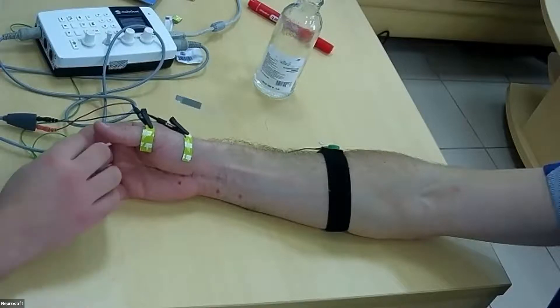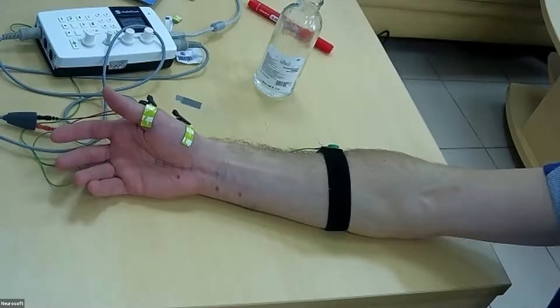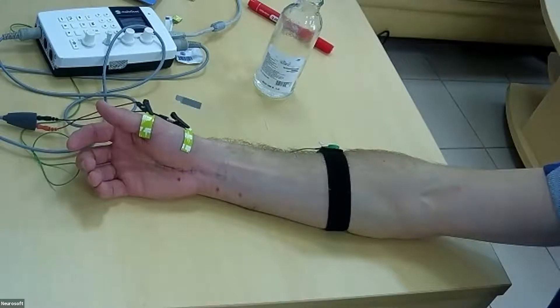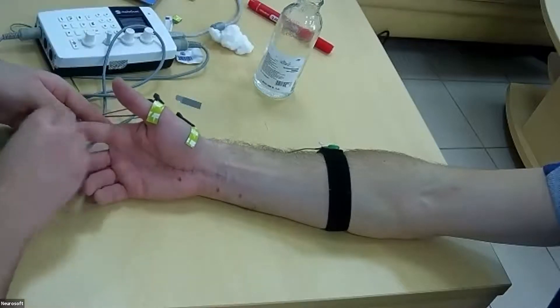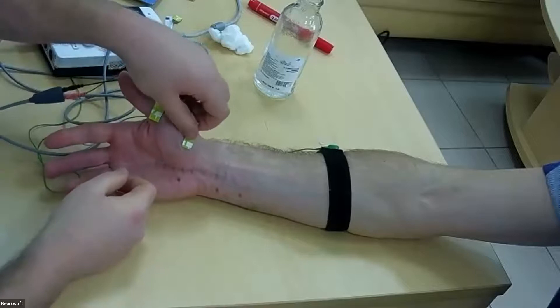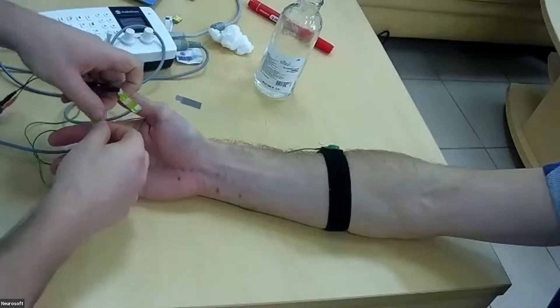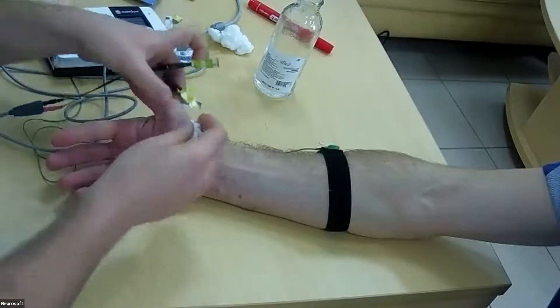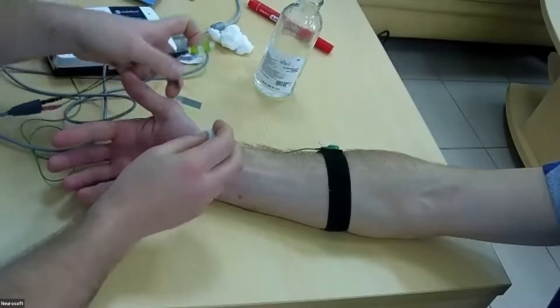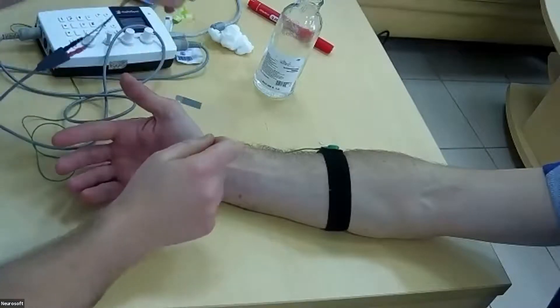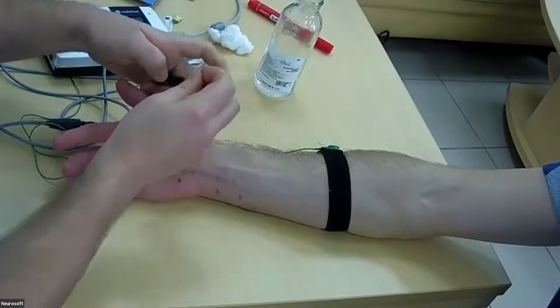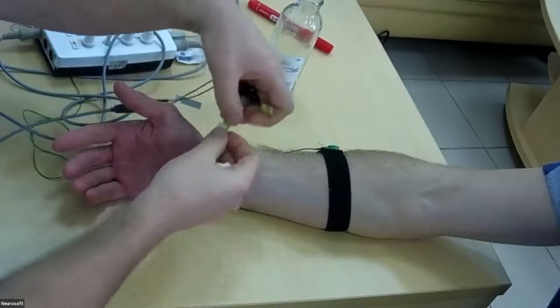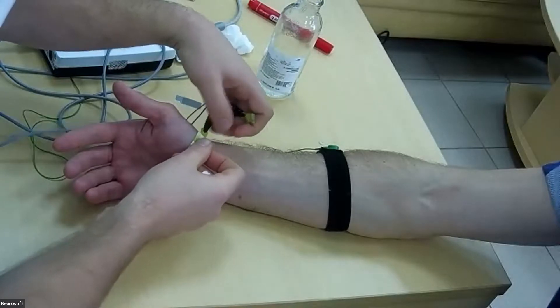Cutaneous silent period. It's a method which is connected with small nerve fibers. So for that we will stimulate distal nerves with electrical stimulation of pain sensors and register activity of the abductor pollicis.